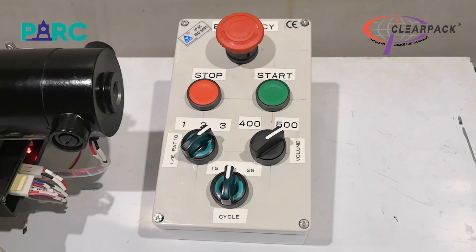There are three parameters that can be set on this respirator: the breathing rate of 15, 20, and 25 breaths per minute; tidal volume of 400 or 500 milliliters; and IE ratio of 1, 2, or 3.